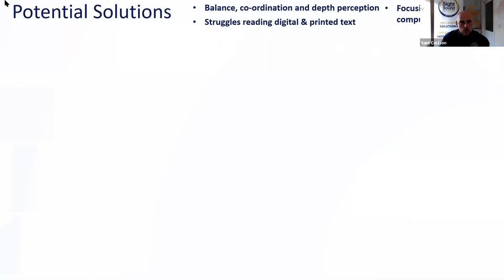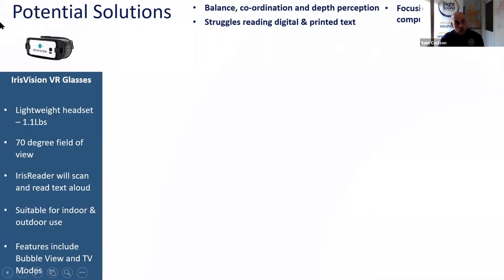Great. Okay, so we've got the potential solutions now, and again we've got the difficulties up there at the top. The first one is another wearable device. I'll stop sharing my screen in a second. Basically, it's an Android smartphone, Android being not an iPhone, which is connected into this smart headset.